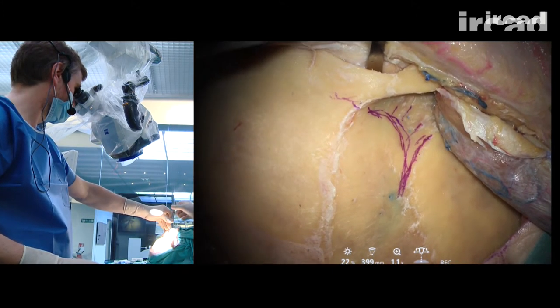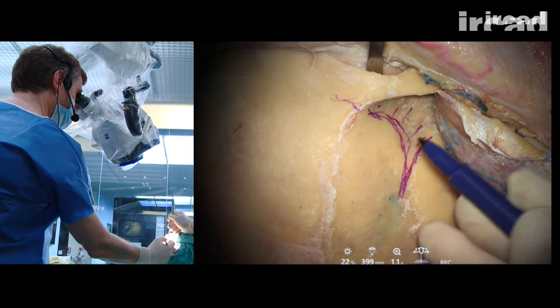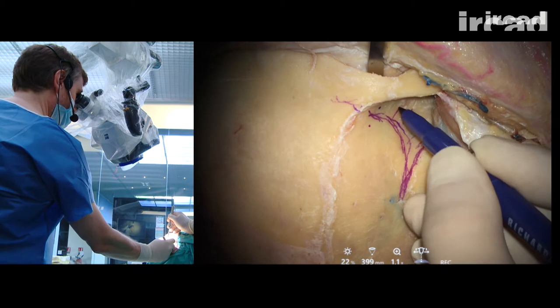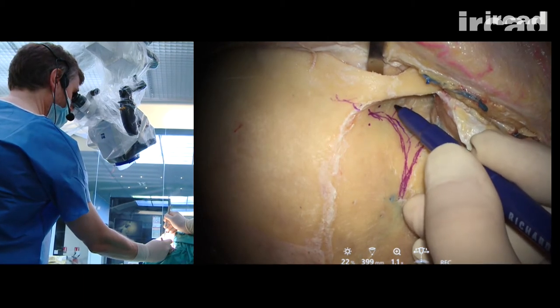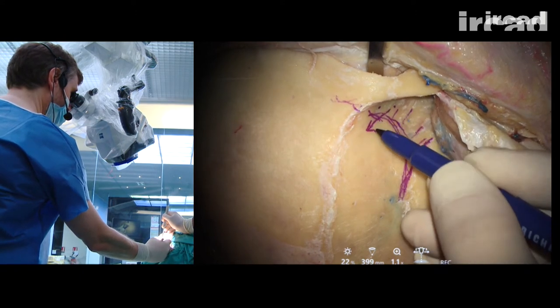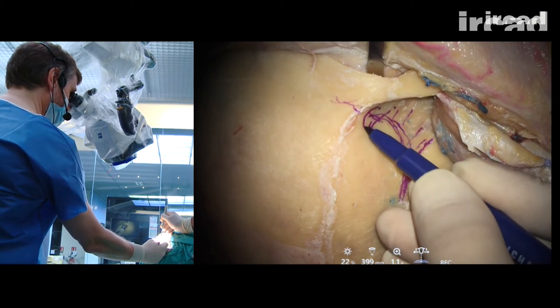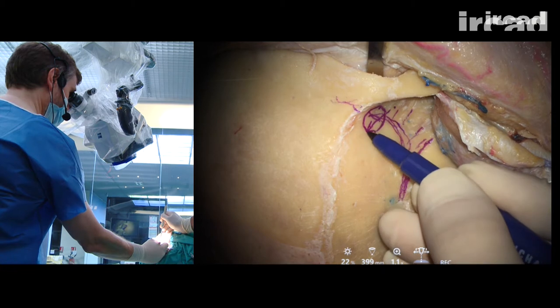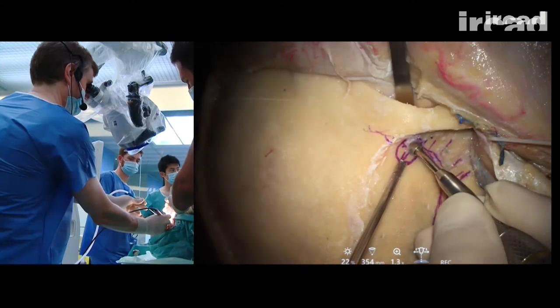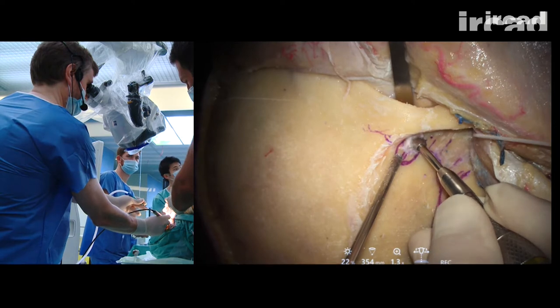Voilà, vous me le tenez comme ça. So here, if I drill, I will find periorbita. If I drill here, I will find dura. If I start my drilling too low to get to the orbit, the distance to the frontal dura is quite long. So here is probably a good position for the McCarty keyhole. So I first drill in the direction of the orbit.